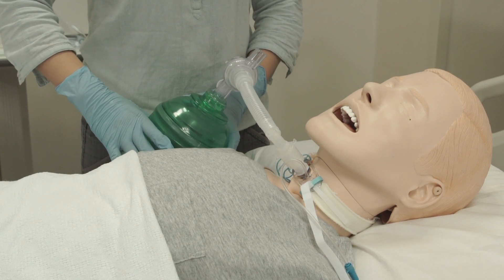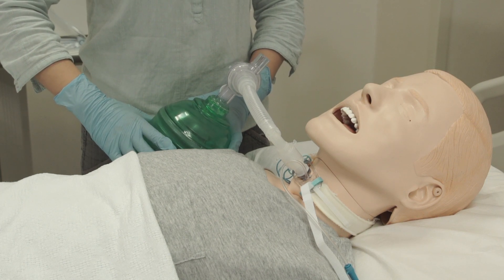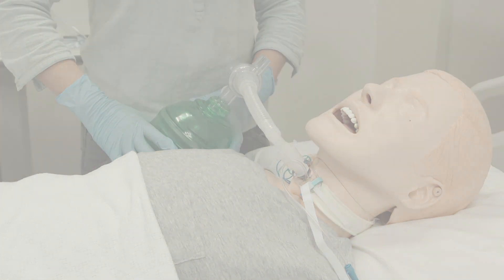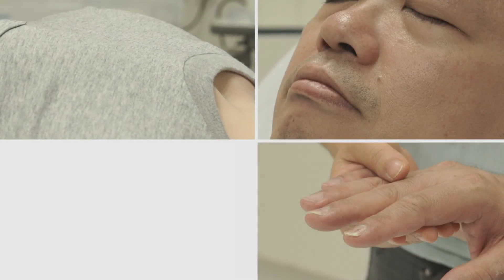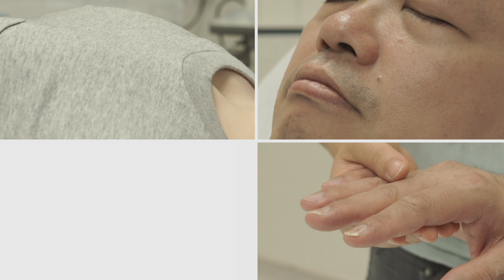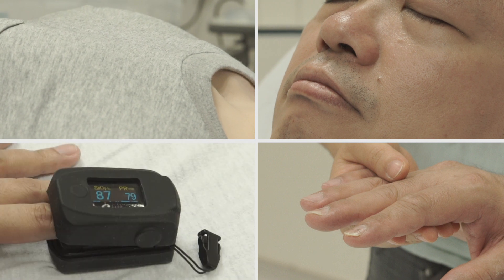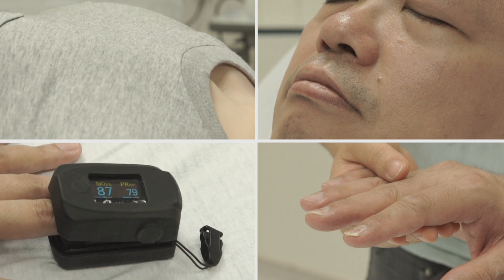If the patient is breathing, squeeze the ambu bag following the patient's breathing pattern. Observe for chest rise and monitor the colour of the patient's face, lips, and fingernails. Monitor SpO2 and heart rate continuously.